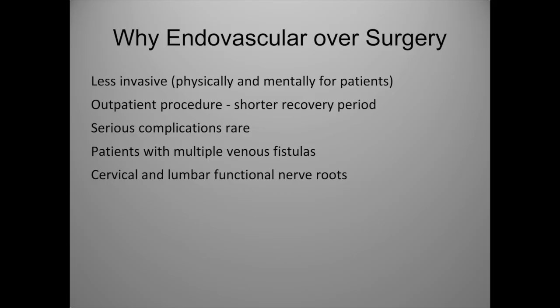It's amenable to treat patients with multiple fistulas, as was discussed. This is something that's being recognized more and more, at a minimum 10% in many publications. It's also probably better for levels of eloquent nerves like cervical or lumbar, where surgery may have some complications afterwards.